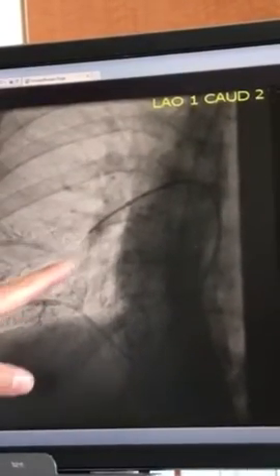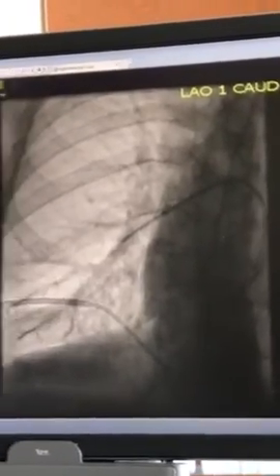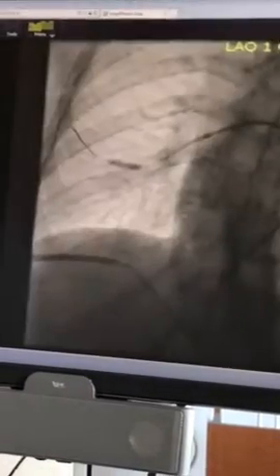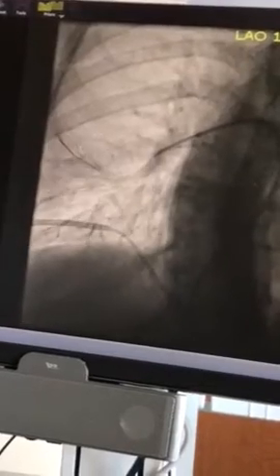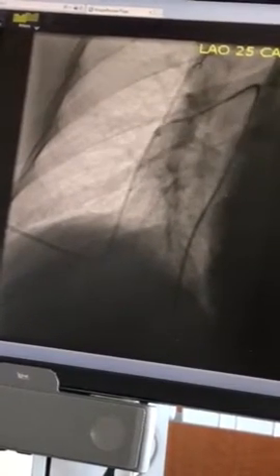So it doesn't, to me, angiographically, look a whole lot different, and we probably wouldn't have sized up any more than that. What's the wire for? That looks like blood flow. There was a big gradient in the upper one, so there was much more of a gradient there, and there's a balloon there. And you can sort of see that there was a flap almost across this. There's sort of this linear opacity that runs across that vessel, and that's gotten better. There's that pressure catheter again, and there was still a gradient, so that's a bigger balloon. And again, after we did that, the vessel looked better, and the gradient improved.